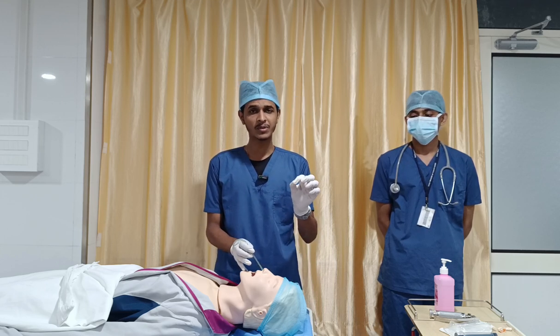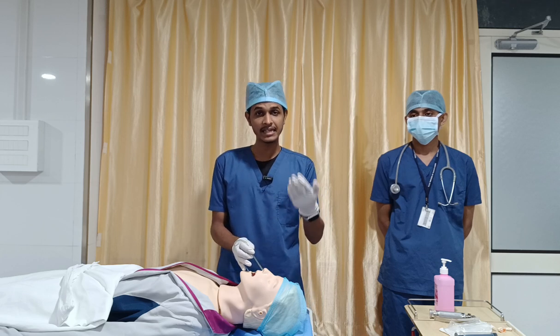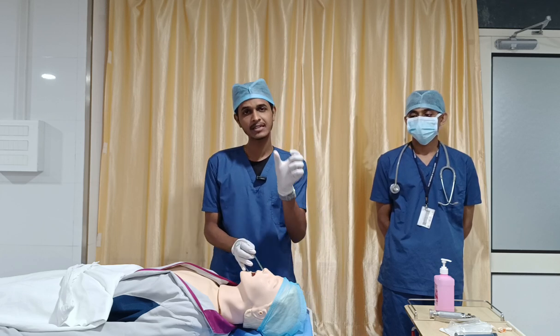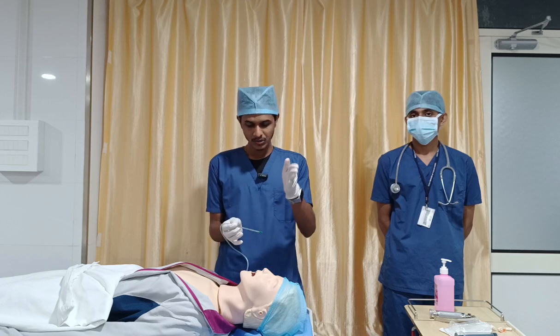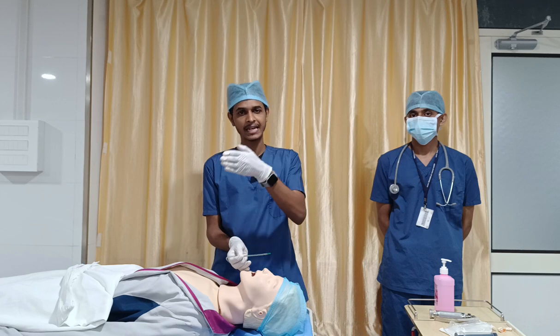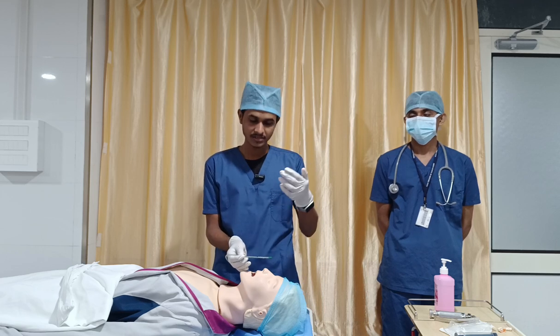Here one more important thing: if the person has a deviated nasal septum, you have to make a choice. If the nasal septum is deviated to the right side, just imagine which nostril you will choose.